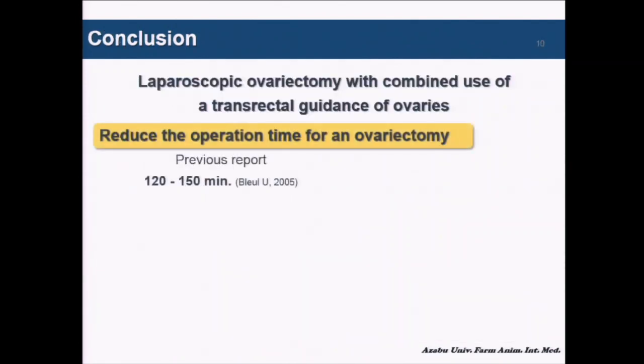I'd like to sum up now. According to previous reports, laparoscopic ovariectomy takes about 120 to 150 minutes to complete. However, in this study, we were able to reduce the time to about 24 minutes, combined with transrectal guidance of the ovary.